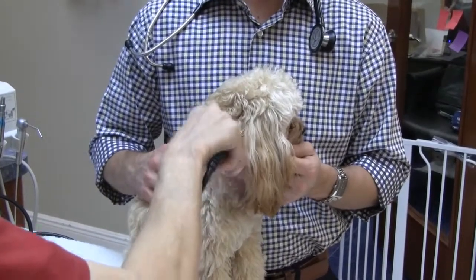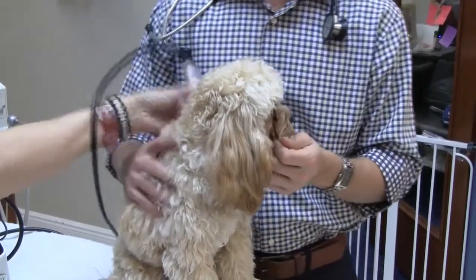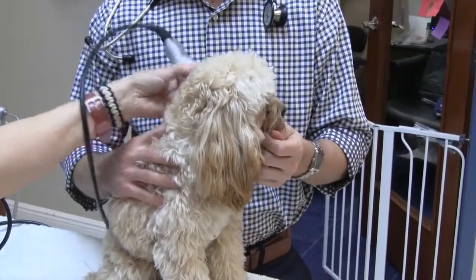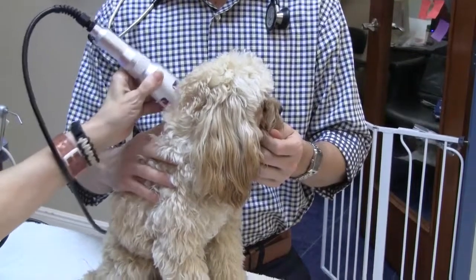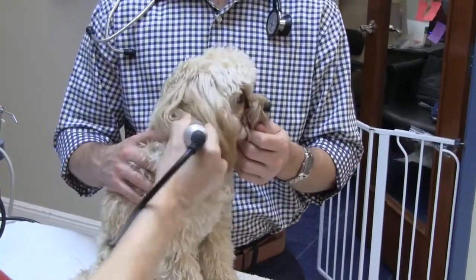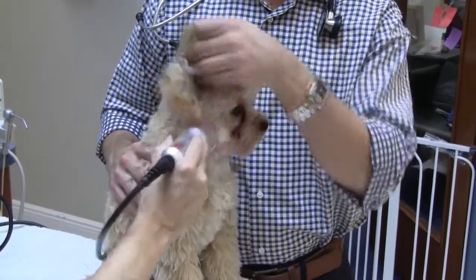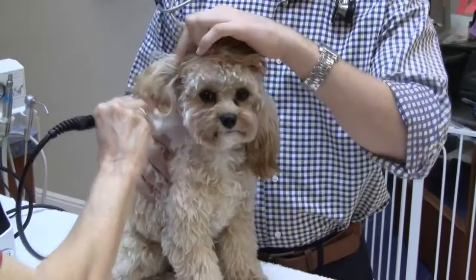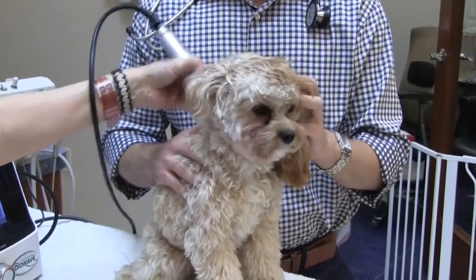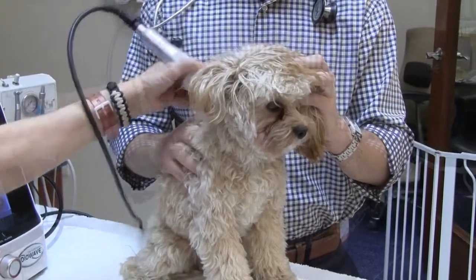One of the other ways to detect the level of warmth being experienced by the patient is to put one of your fingers in the laser field. That way you're getting pretty much the same therapy that she is, and you can feel if it is too uncomfortable for you, and if it is uncomfortable for you, it's more than likely uncomfortable for her. Black dogs are your biggest concern because I can sit here and laser her and she's barely going to feel warm. But if this was a black dog, it would be hot. Black dogs get much hotter, much quicker than light colored dogs.